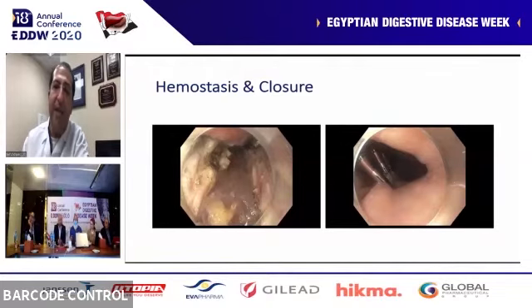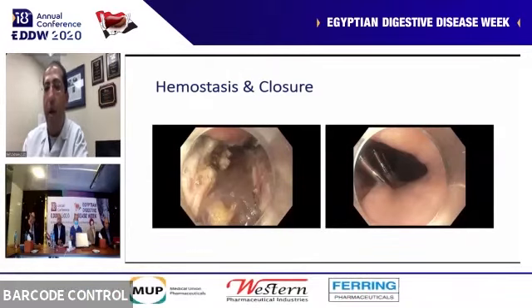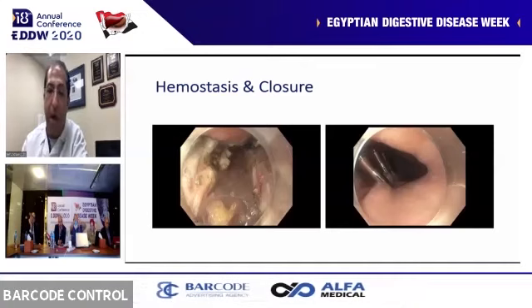There's a lot of technicality about how long a myotomy you do above and below the GE junction. People started by doing a 10 centimeter or 12 centimeter myotomy above the GE junction and 2 to 3 centimeters below. I know a lot of my colleagues only do 2 below and 8 above, even 2 below and 6 above.